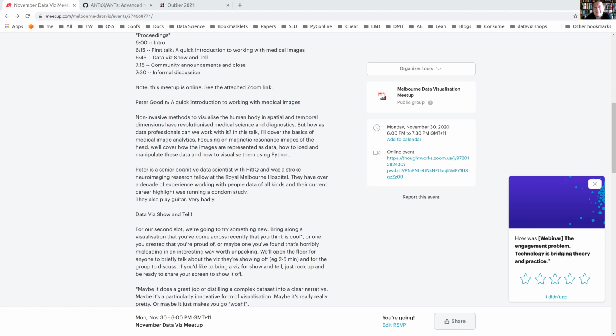All right. So in that case, the delayed outro is: we've taken our data and loaded it into Python, we've done some basic manipulation using NumPy in creating brain masks and done some basic rotation on it. We've bias corrected the data to get rid of the shadowing that exists because of inhomogeneities in the magnetic field.